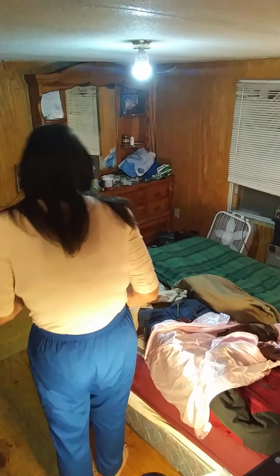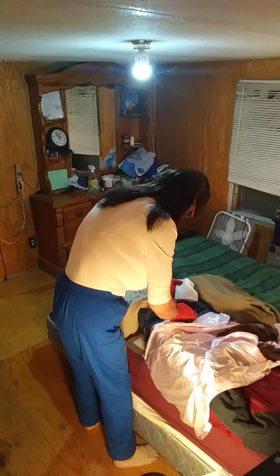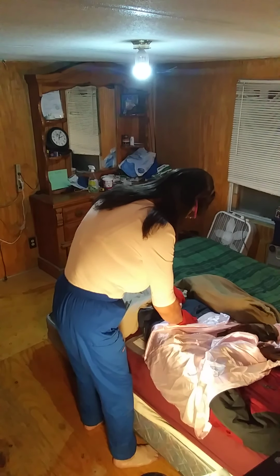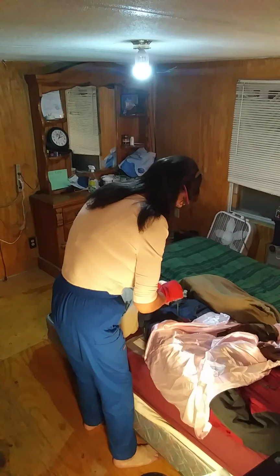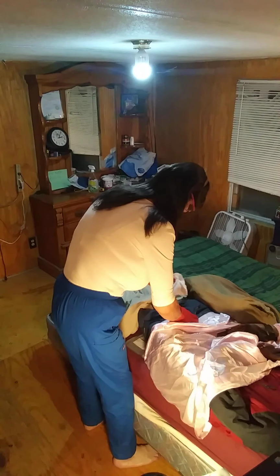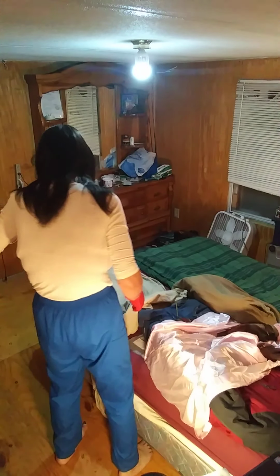Now we're going to dry. Same thing again. We're going to hold the catheter right as close to the meatus as possible. We're going to dry it without pulling on it. Once. Let me know if I'm causing you any pain any time, Miss Cheswick, okay? Trying to be very careful. Twice. Okay, so we dried that. And we're going to put that in the soiled linens.